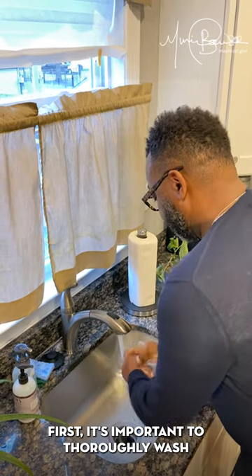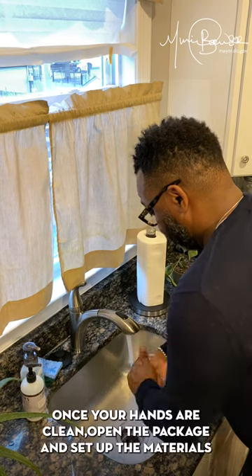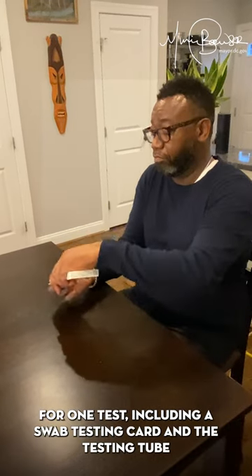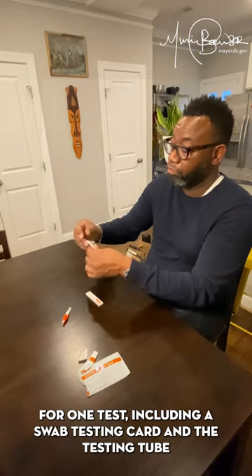First, it's important to thoroughly wash or sanitize your hands before taking the test. Once your hands are clean, open the package and set up the materials for one test, including a swab, testing card, and the testing tube.